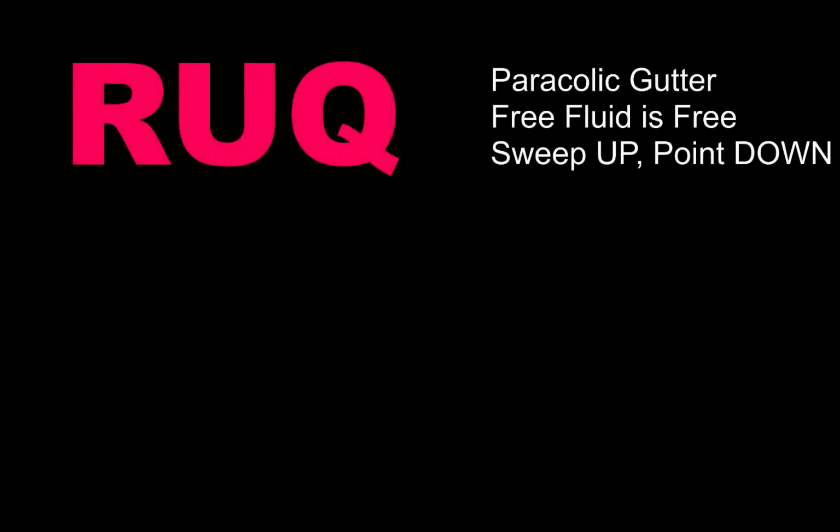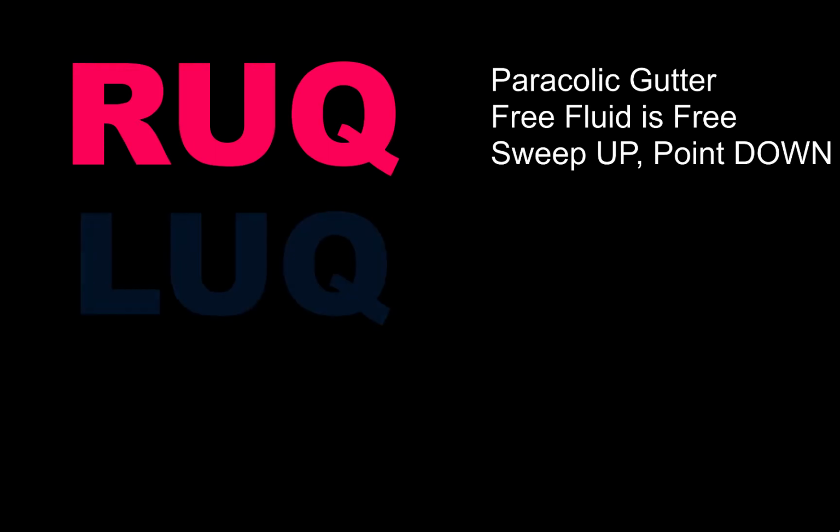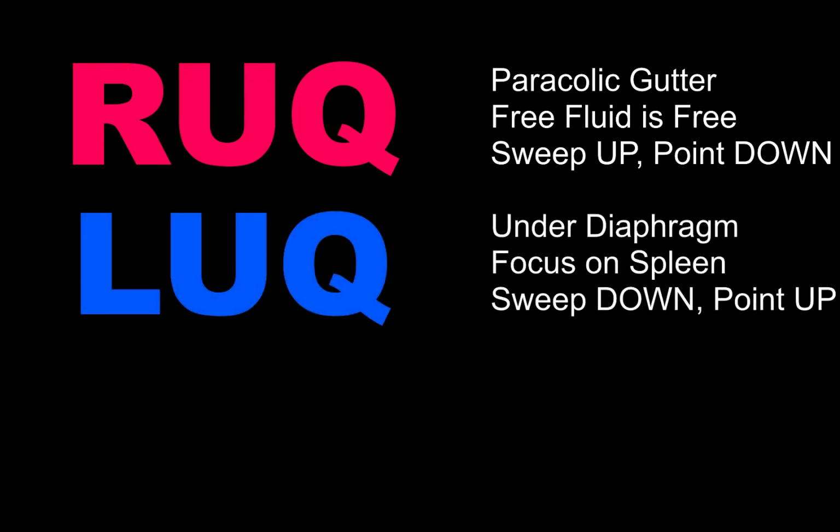In general, for the right upper quadrant, remember that the paracolic gutter is the most sensitive area, that free fluid has to be free, and that you can sweep anterior and point posterior to use the liver as an acoustic window. For the left upper quadrant, remember that a lot of blood can hide under the diaphragm compared to the right upper quadrant. You can focus in on it around the spleen and not the kidney, and your best chance is to sweep down and point up, unlike the right upper quadrant, where you sweep up and point down.